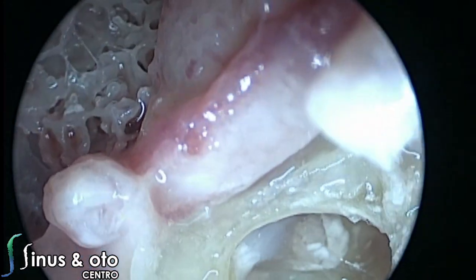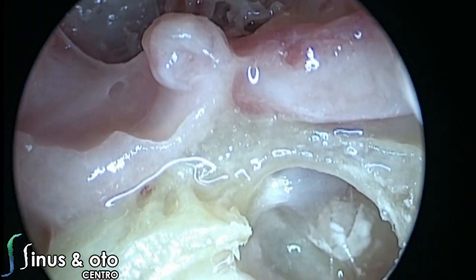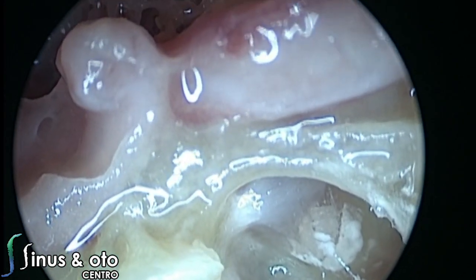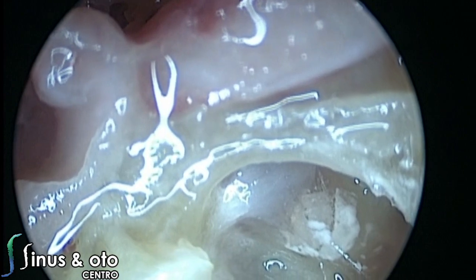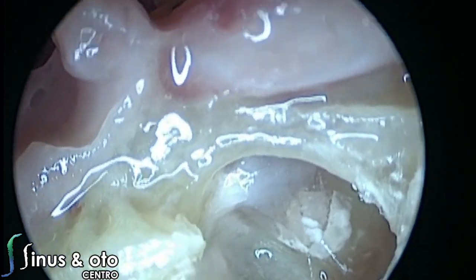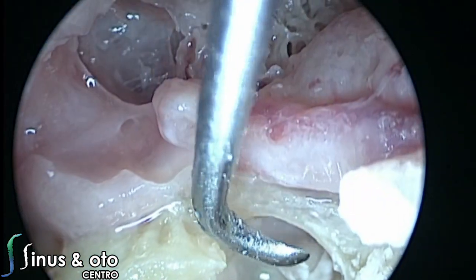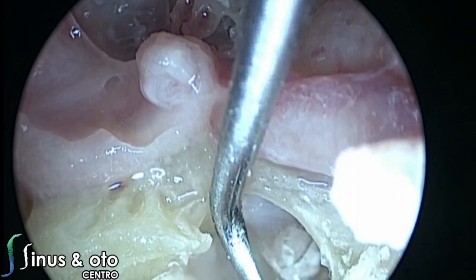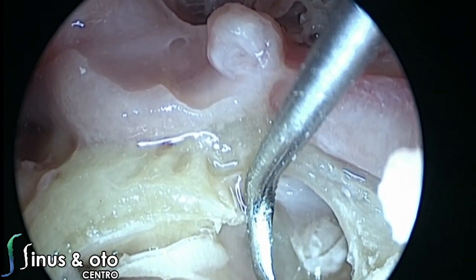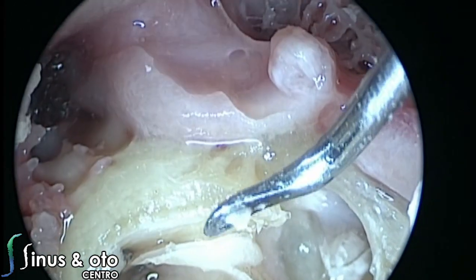Inside the vestibule you also have the spherical recess and the elliptical recess. The elliptical recess is above, this is the vestibular crest, and then you have the spherical recess. The elliptical recess is the attachment of the superior vestibular nerve, the spherical recess is the attachment of the inferior vestibular nerve, and the vestibular crest separates these two structures. Once again, we see the endolymphatic sac, the spherical recess, the elliptical recess above, and of course the vestibular crest between those.